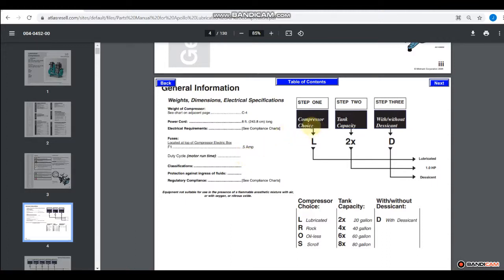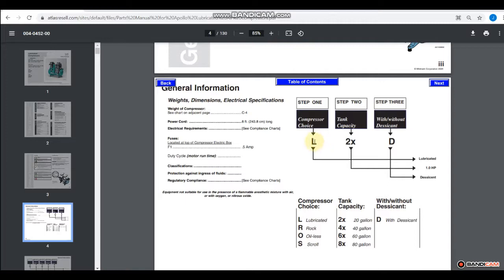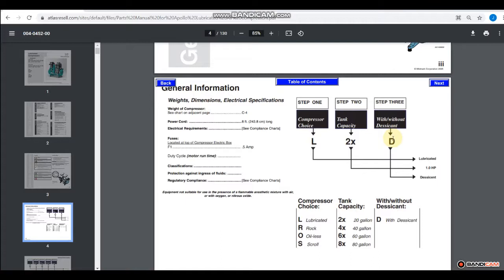So here we have basically three little areas. The first one is a choice between lubricated, rock, oilless, or scroll. So for our purposes, lubricated compressor is the one that we're going to be seeing on that part number. The tank capacity is going to be either 20, 40, 60, or 80 gallon tank based on what that number says, and then the D indicates if there's desiccant.